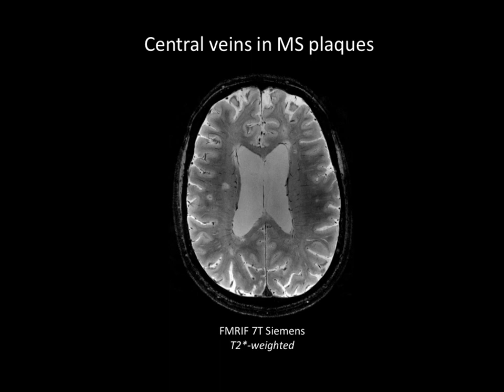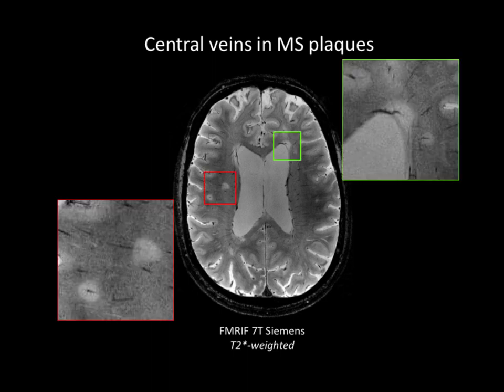And of course, with the advance of the technology, higher field strength, stronger magnets, stronger gradients, you can really push the in vivo resolution. This is data that I collected here at the NIH using the 7 Tesla scanner that maybe some of you are scanning on for the fMRI experiment. So it's a patient that we put in the scanner that obviously has MS. And you can see those hyperintense lesions in round shape, and then right through the center of this, you can see this dark line running through partially or entirely, which are actually those central veins that Charcot described back in the 19th century.